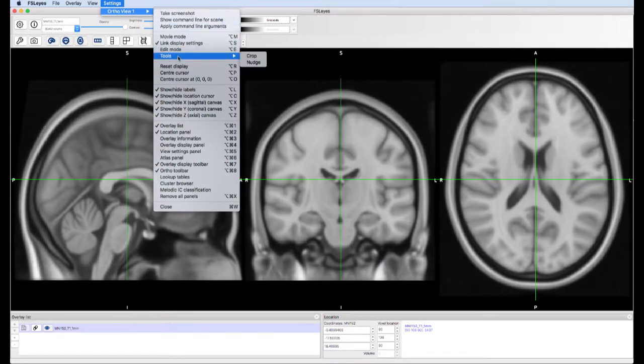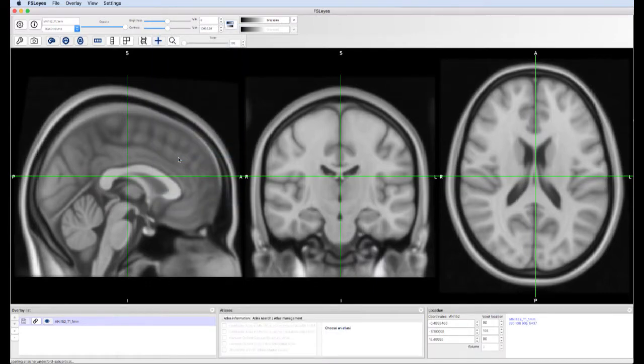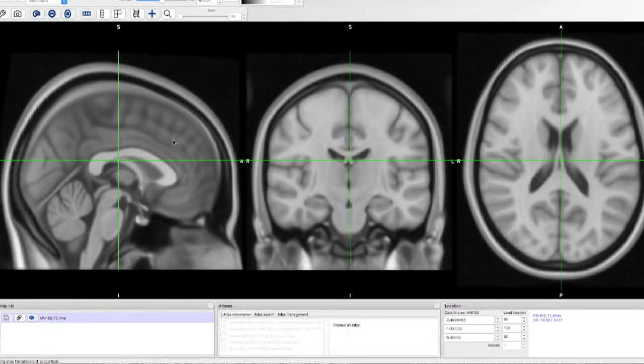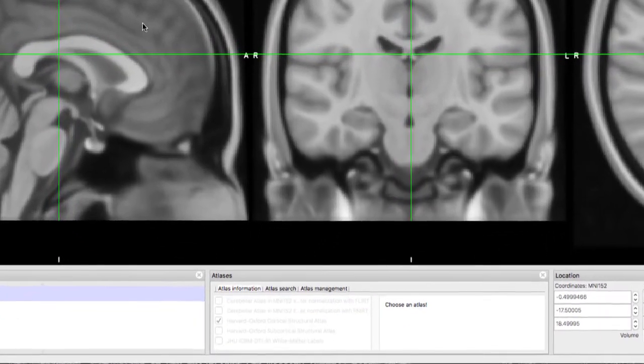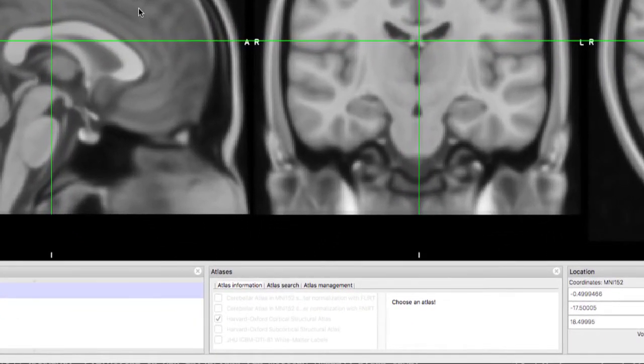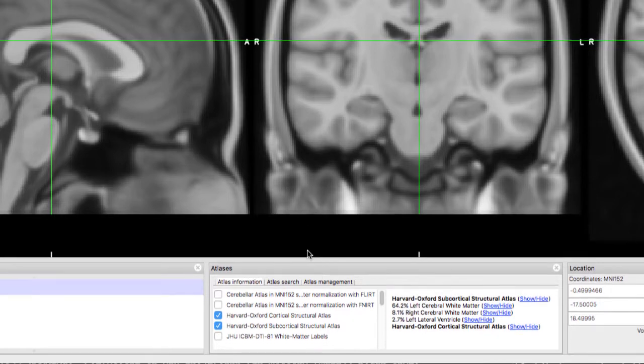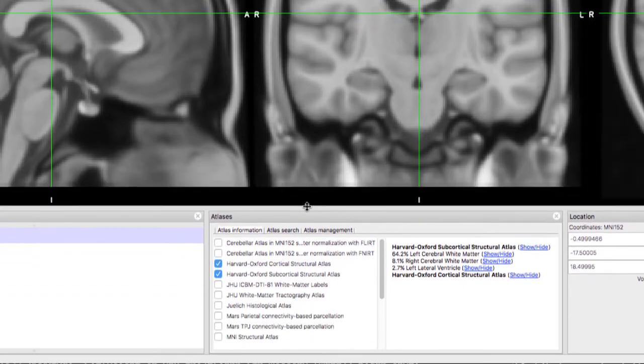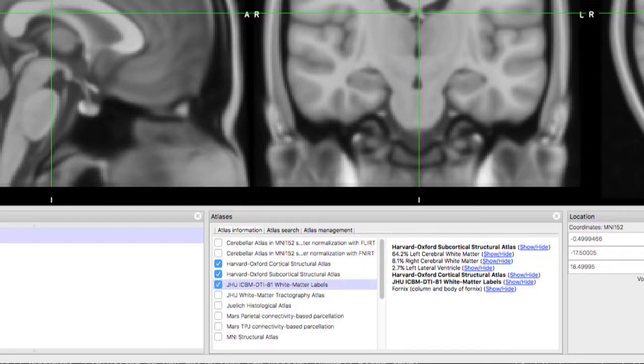This opens up a panel at the bottom with three tabs. The Harvard-Oxford cortical and subcortical atlases are loaded by default. The Atlas information box shows which atlases are available. Checking the box next to an atlas shows which structure belongs to the voxel under your crosshair.